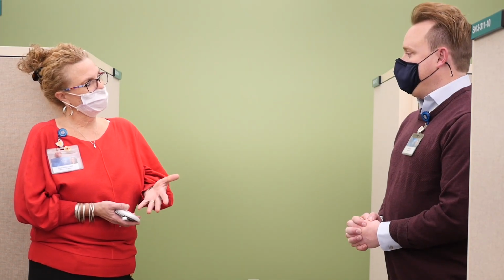He's like, what is it going to take for me not to have to wear this for 30 days? And I said, just kiddingly, I said, well, go home and have something happen. Lo and behold, it did. In our night shift, that first night he went home, so his 6th night after he had surgery and passed out at home, he had a 7-second pause in the middle of the night. The techs caught it, called his primary doctor. He was in, had a pacemaker by 8 o'clock in the morning the next day.